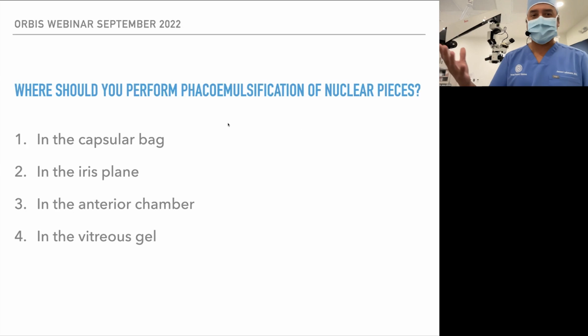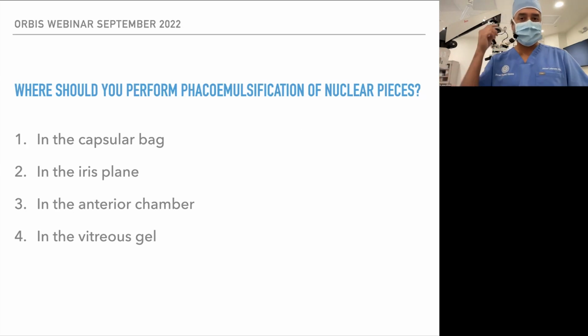So here's a question about phaco. Where should you perform phacoemulsification of the nuclear pieces? So what part of the eye? In the capsular bag, in the iris plane, in the anterior chamber, or in the vitreous gel?